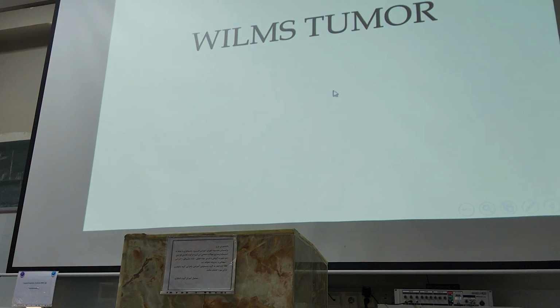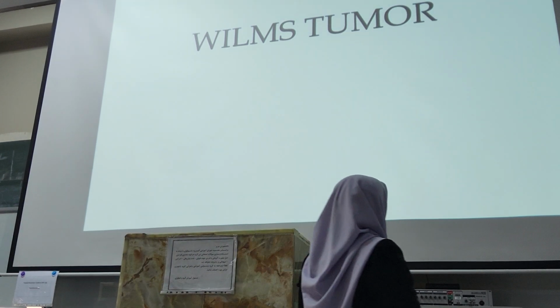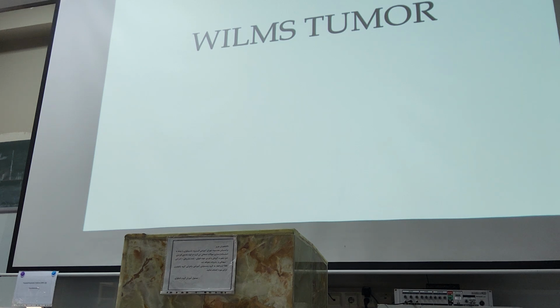Any question about neuroblastoma? No. What is neuropil? Neuropil is the cytoplasmic extension of neuroblasts. Okay? In most cases, you have neuropil. The presence of neuropil is in favor of more differentiation of the neuroblasts.